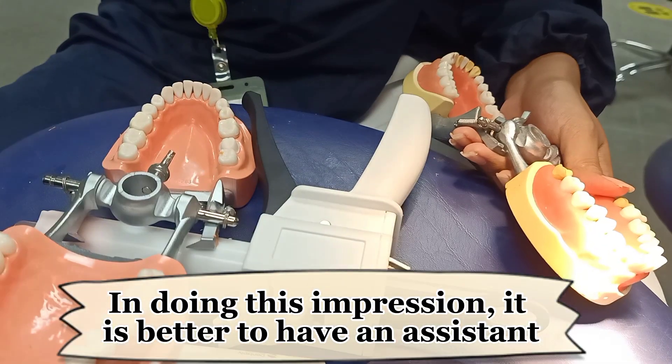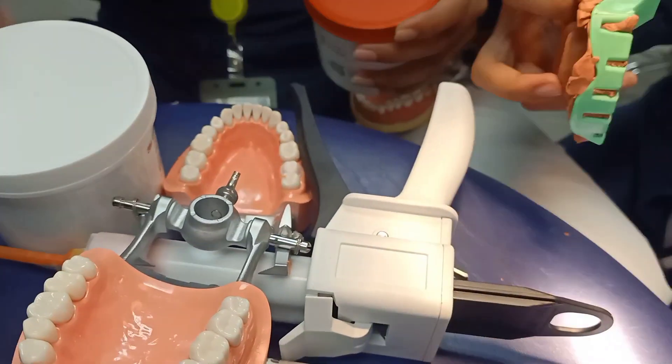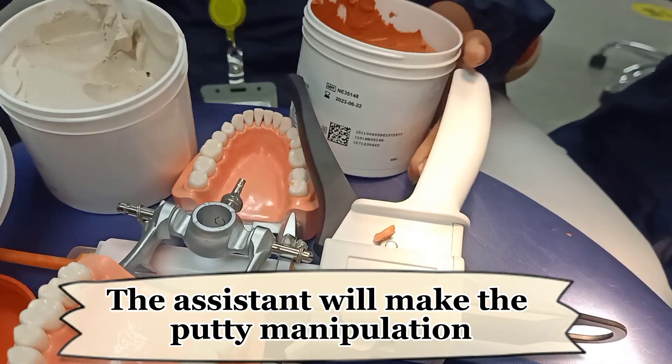In doing this impression, it is better to have an assistant. The assistant will make the putty manipulation.